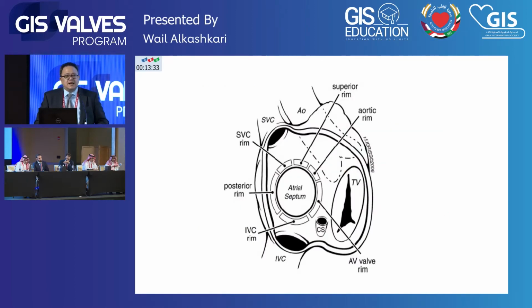So I want you to take a picture of this, for the people who want to do ASD. This is a very important slide by Zahid Amin. He's well known, and I did my training with him in Chicago. He divided the septum into the following.